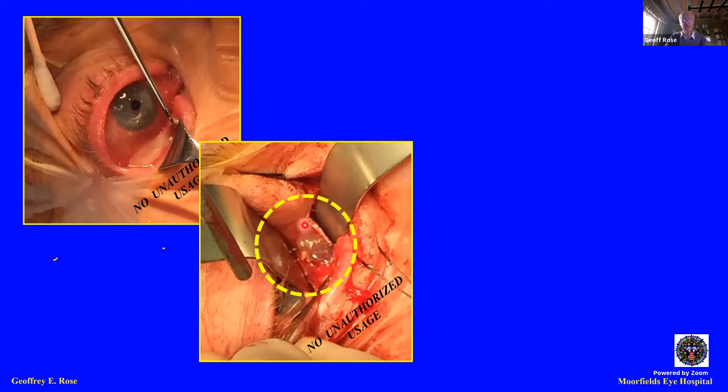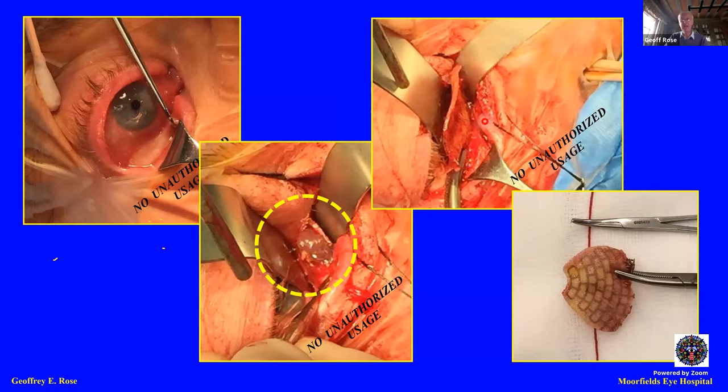That's one complication. When we explored the area, there was some mucus around. We're about to do a DCR and remove the implant, because you don't want that through your lacrimal system. It was an unnecessarily large implant for what was going on. Most of them don't need metalwork like that, and certainly don't put it through the sac.